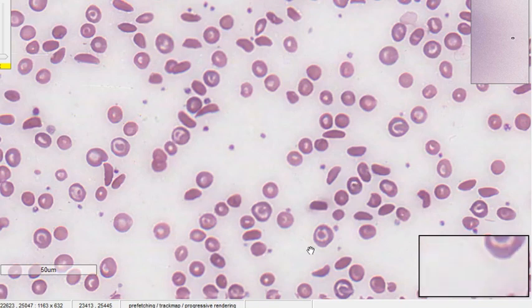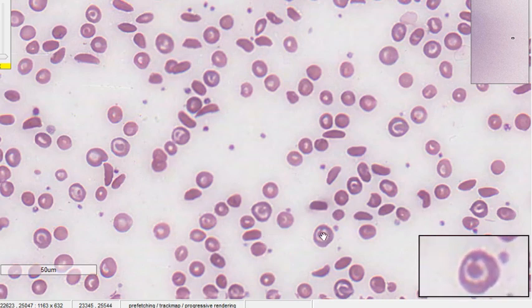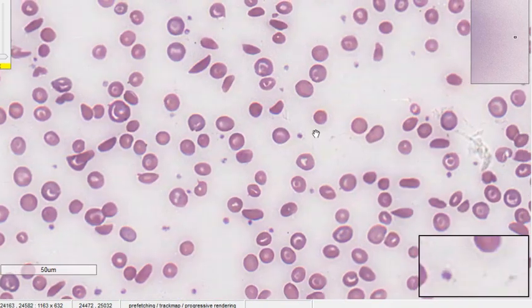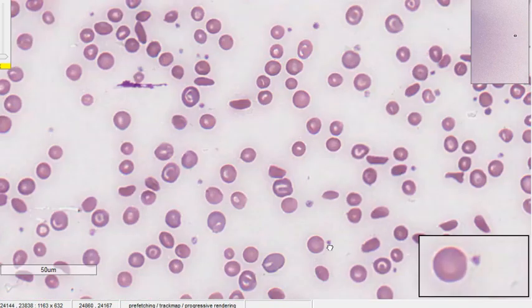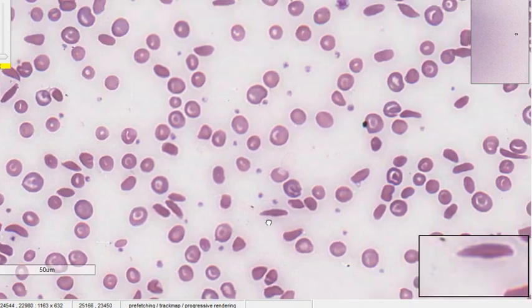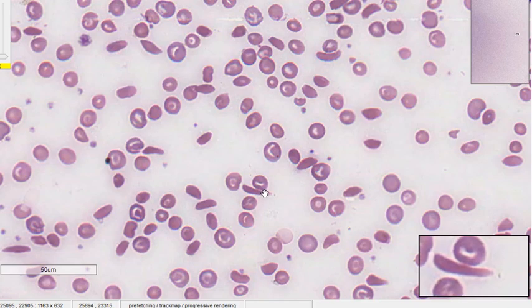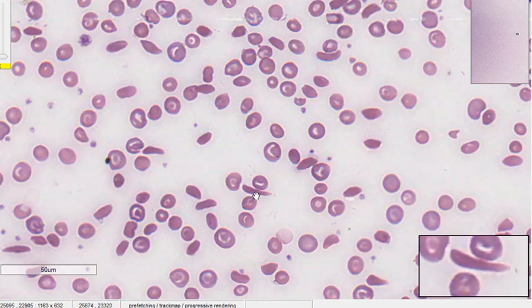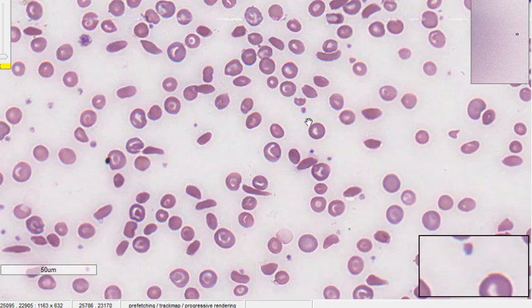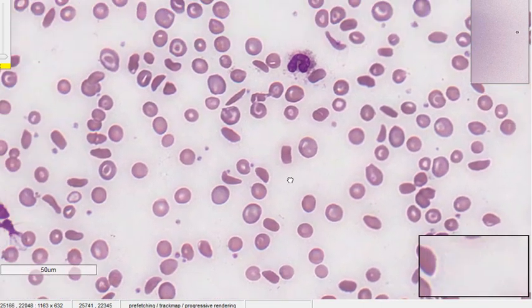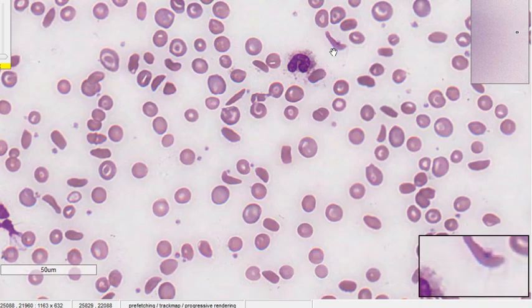There is anisopolocytosis — variation in both size and shape of the RBCs — and there are target cells that look like targets. The most evident finding is the large number of sickled RBCs throughout the smear. A sickled RBC has no central pallor, a sharper outline, and a sickle shape. Some have more of a boat-like shape rather than a classic sickle shape.